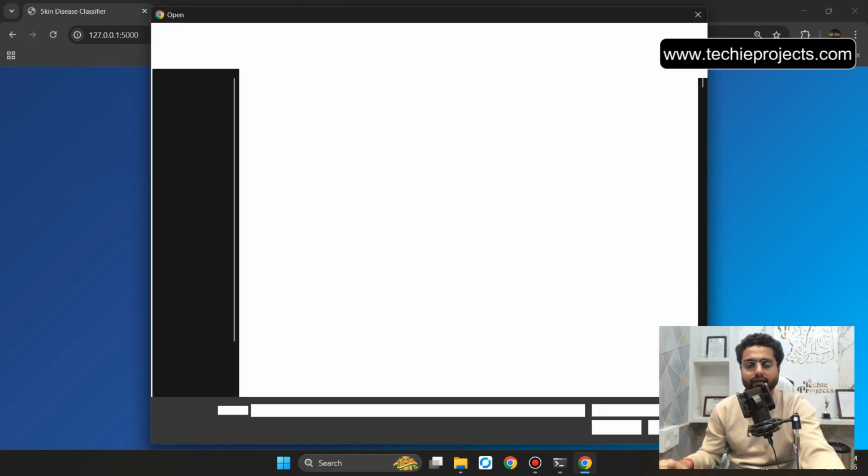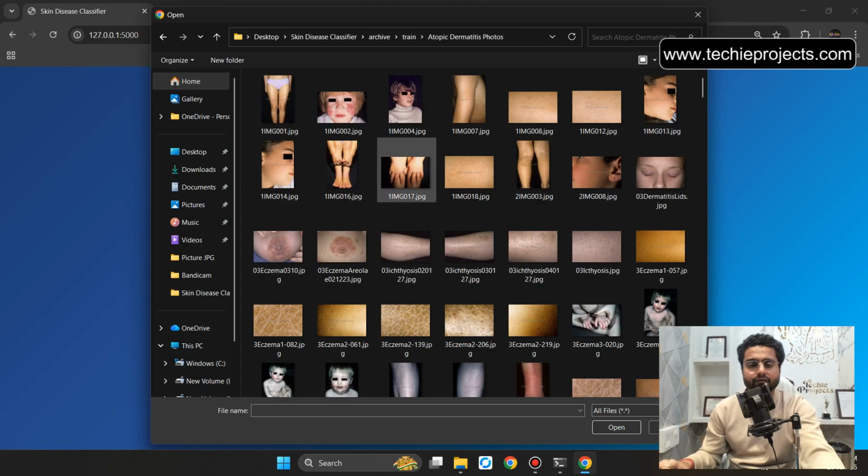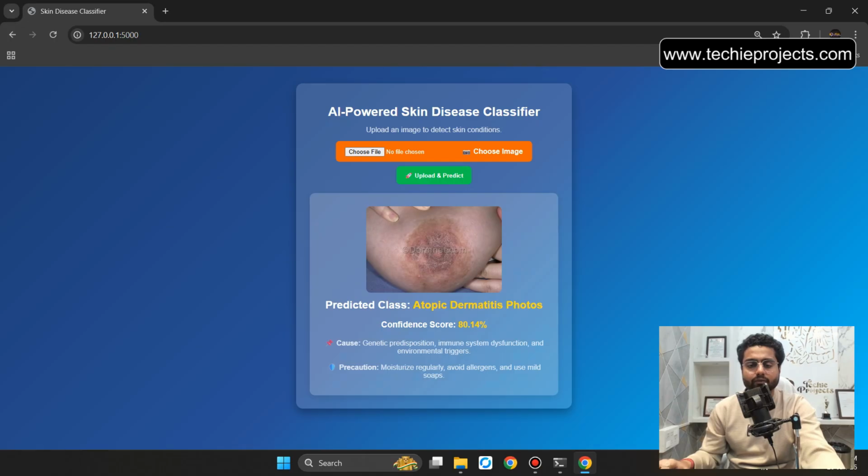So let's click on choose file. Let's upload any other image. Select from that particular folder and let's select this image. Then click on upload and predict. So it predicts the atopic dermatitis photos and the confidence score 80.14% and the cause: genetic predispositions, immune system dysfunction and environmental triggers.